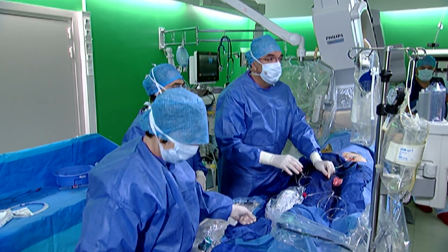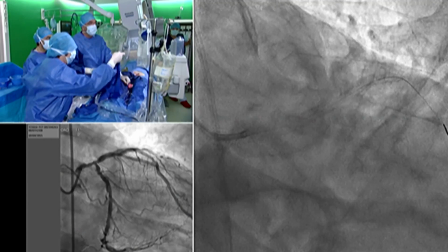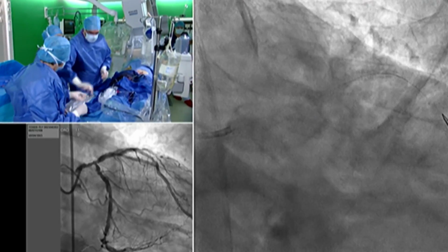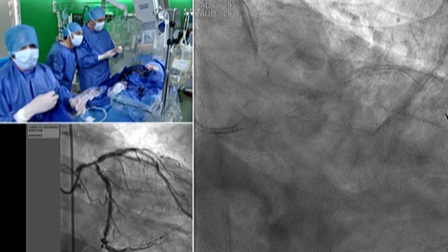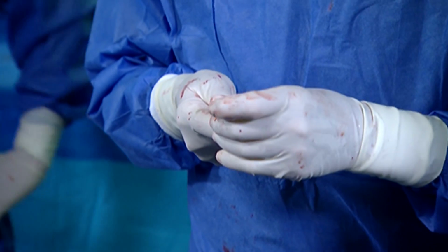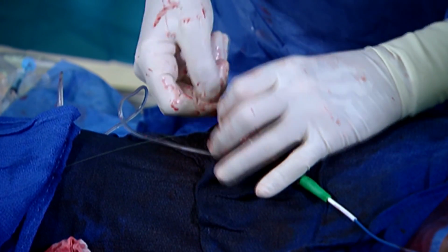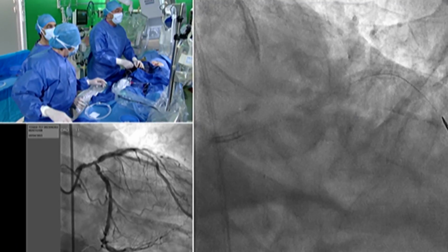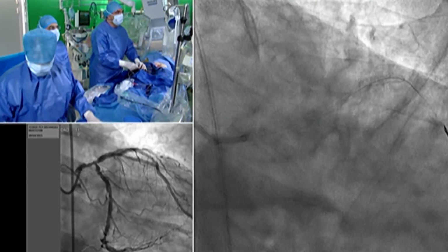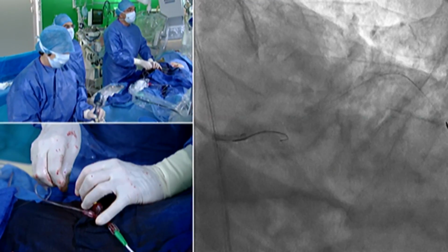It is after the bifurcation, eh, Jean? You can do even without recrossing, if you want. Because it's after the bifurcation, so we can do even without a recrossing eventually. But I'm afraid that if I am doing a mistake, I can crush my LCX stent. So I will try to place the wire in LCX, place a 3.5 millimeter balloon in the LCX. It could be a compliant balloon, no problem. And then what do you say, 4.0 in proximal LAD or larger?